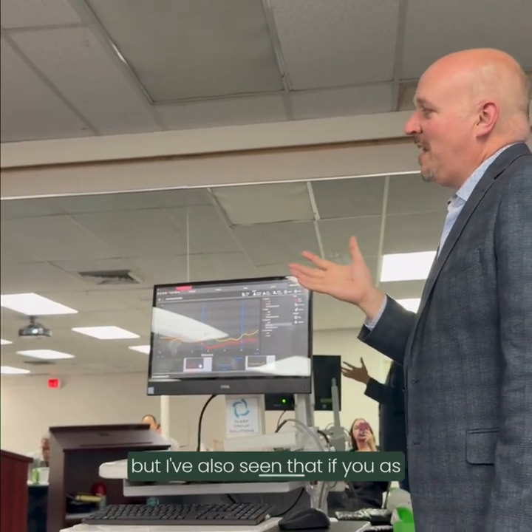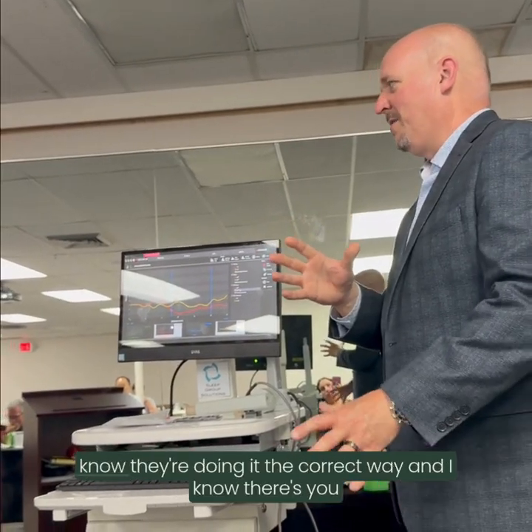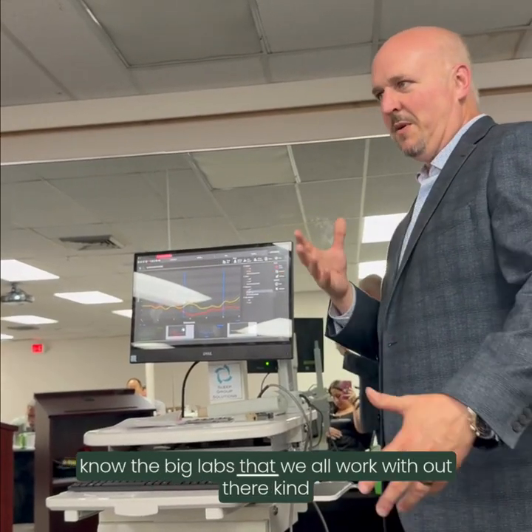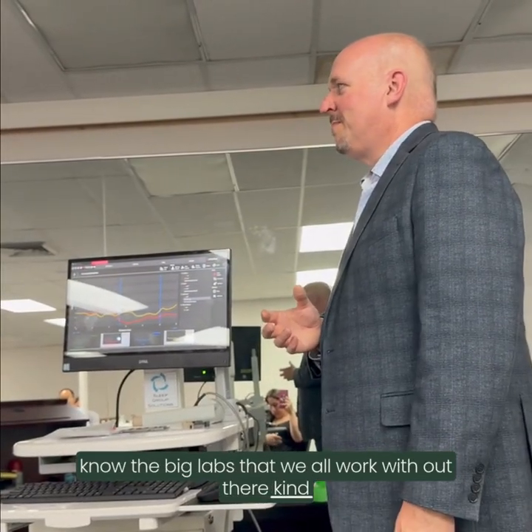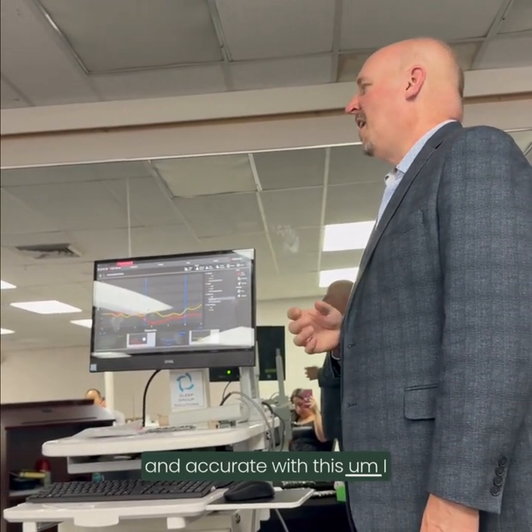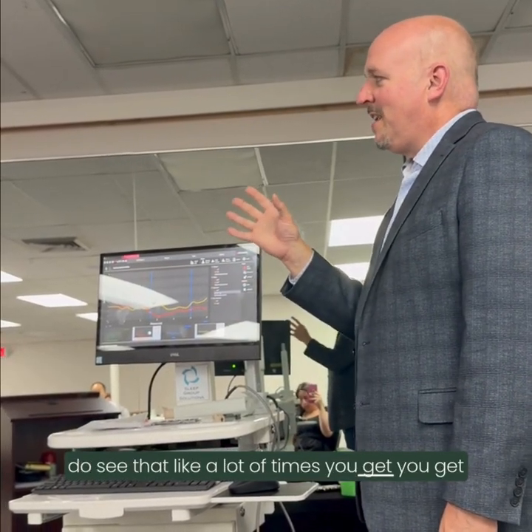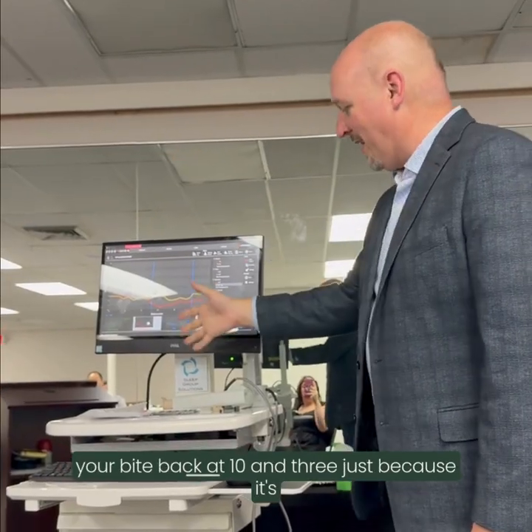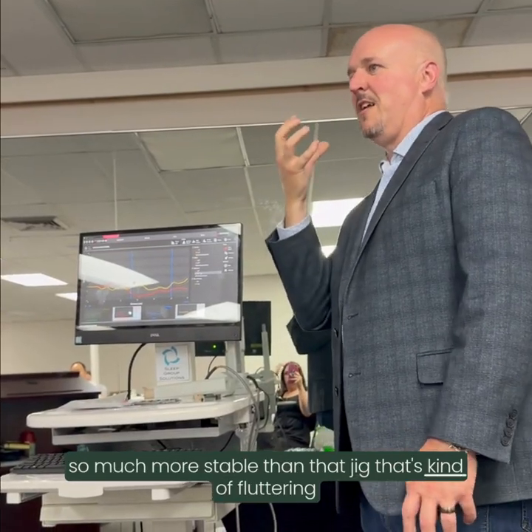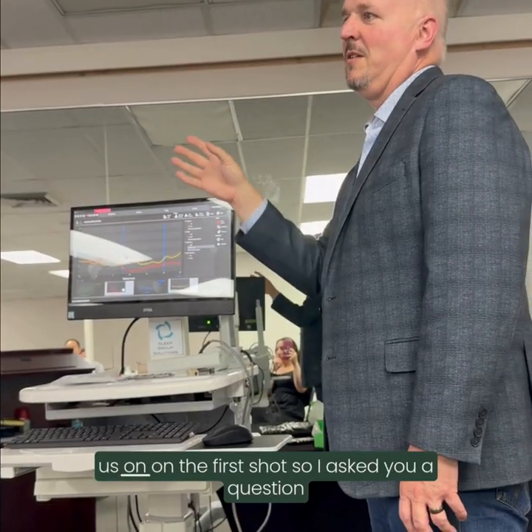But I've also seen that as long as they're close and they're doing their bite the correct way, and I know the big labs that we all work with pride themselves on being very precise and accurate with this, a lot of times if you get your bite back at 10 and 3, just because it's so much more stable than that jig that's kind of fluttering in their mouth, you get an even better result than this gave us on the first shot.